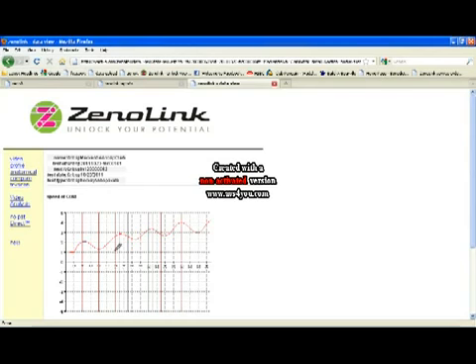The lull we'd like to see kind of peak out. Like here we see the lull occur right at mid-stance, and here the lull occurs after mid-stance and again on the next gait cycle. So we'd like to see the lull occur right through mid-stance and then get a better burst of speed from mid-stance to toe off. So that pattern could be a little bit better, especially in the gait.